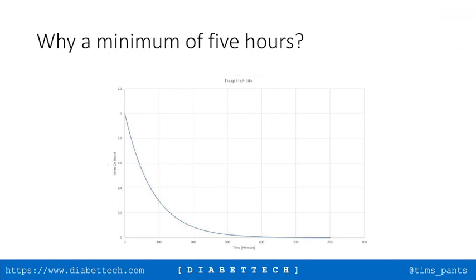Yeah, thank you. The way I find it useful to explain sometimes is the DIA, the duration numbers that people have got used to on old traditional pumps, is an approximation that matches those pumps. Yes. We are using a different model that matches reality.